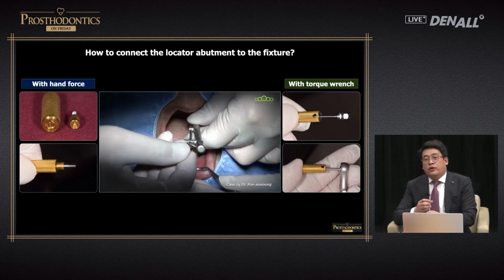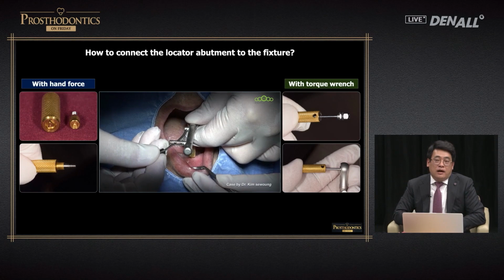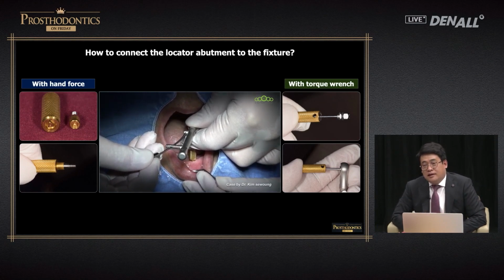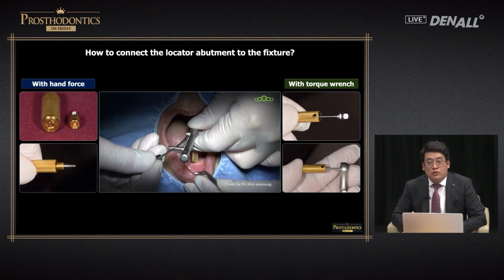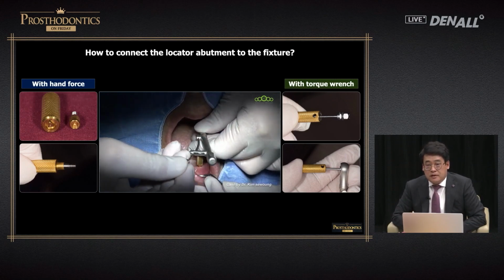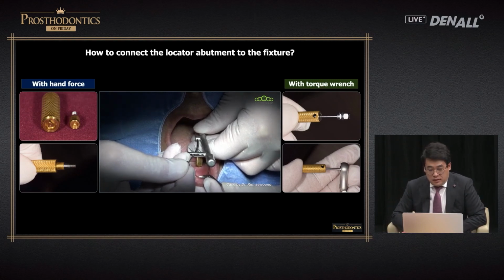Apart from locator core tool, there is a dedicated torque driver for locator from Ostem. You can use these, but in order to use these, you need to pay additional money. And you can tighten sufficiently using the first part of the locator core tool.